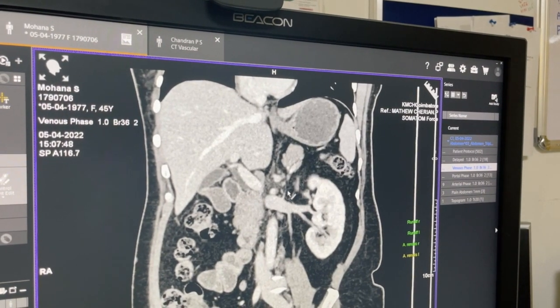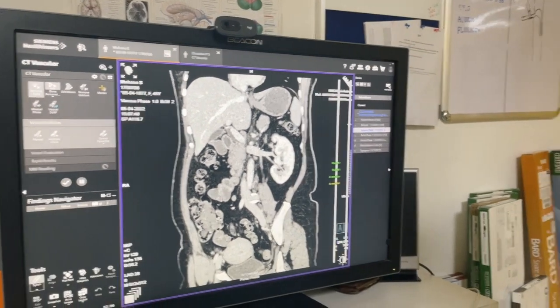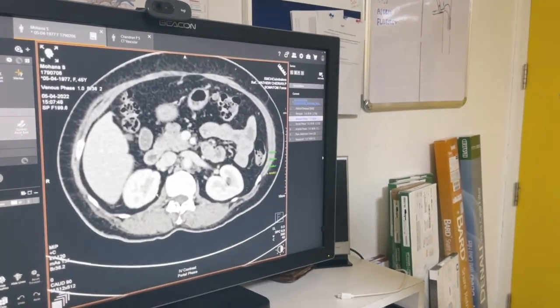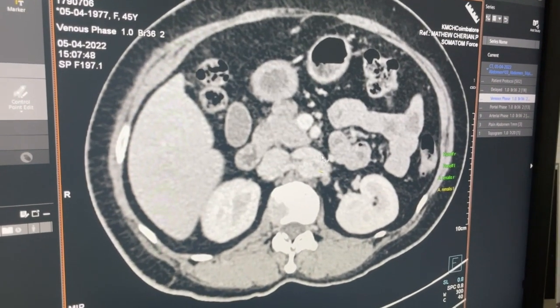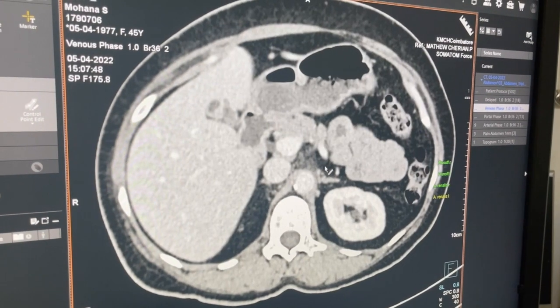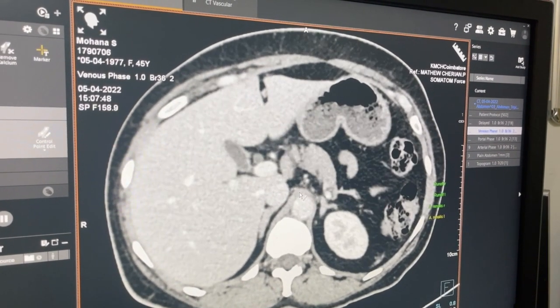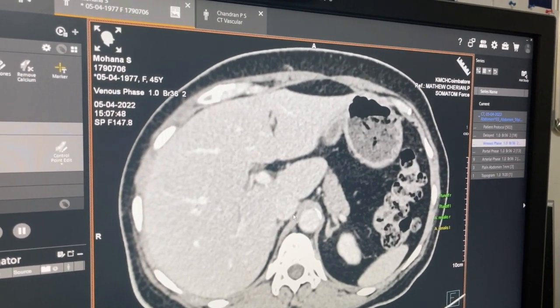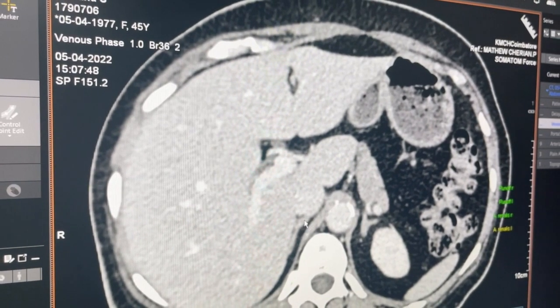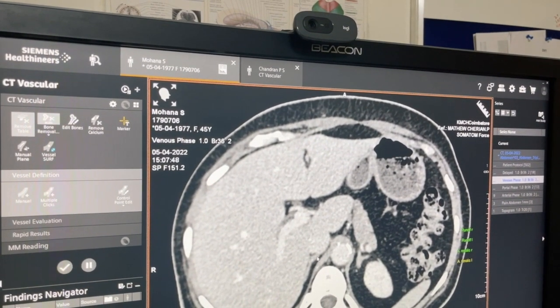So we have a clear picture of the left side: the left adrenal vein comes from the left renal at about 1.7 centimeters, opening upward. It is far more challenging on the right side because the right adrenal vein has no definite fixed position. In a good study you should be able to see it — first locate the adrenal gland, then identify a vessel joining the adrenal vein. It is separate from the diaphragmatic crus, and its location is at the six o'clock position — bang posterior.